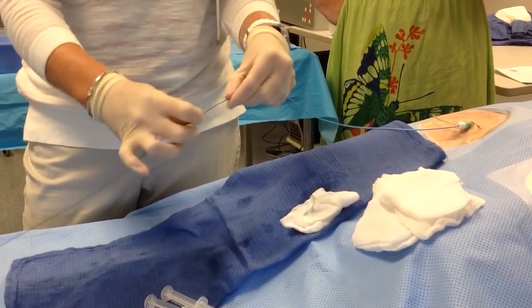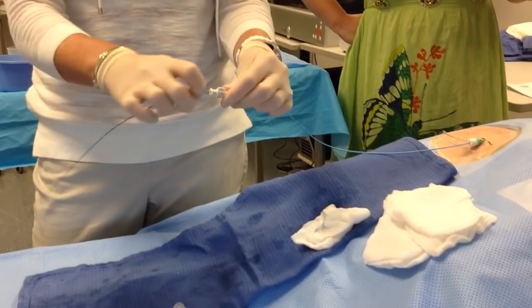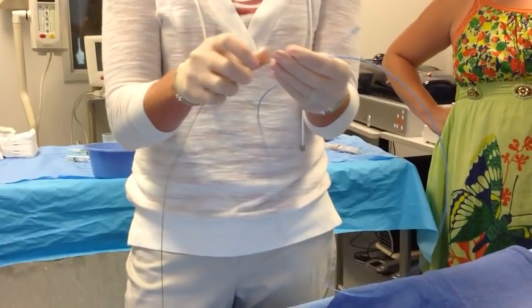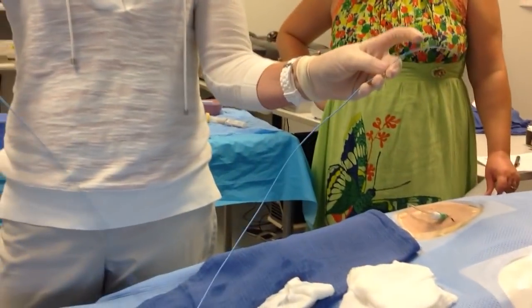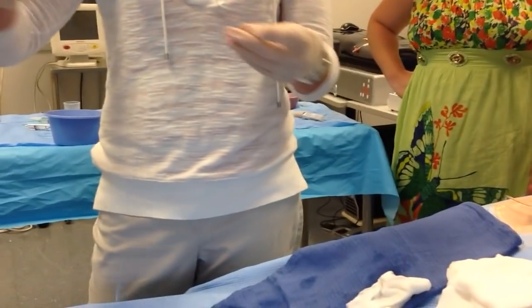Everything gets caught on everything, too. And you'll meet resistance with the pigtail. And you just want to go a little bit past it. And go past it. But when it comes out, it should be like that. So the pigtail straightened. Okay. So when you meet resistance, just go a couple inches past it, and then you can take everything out together.